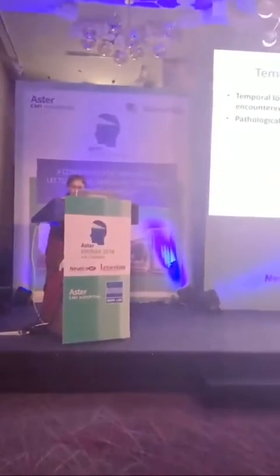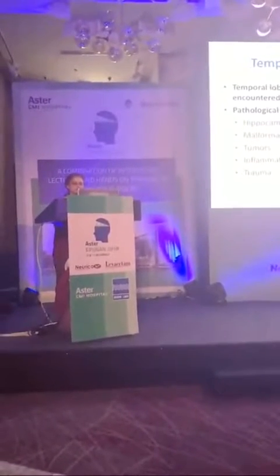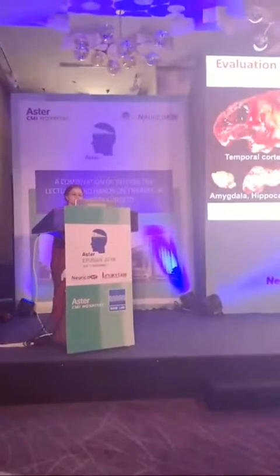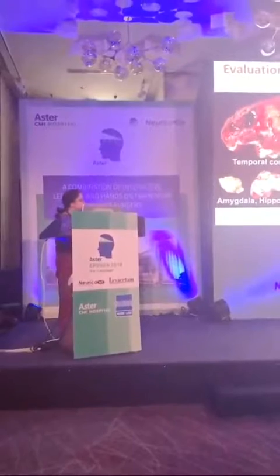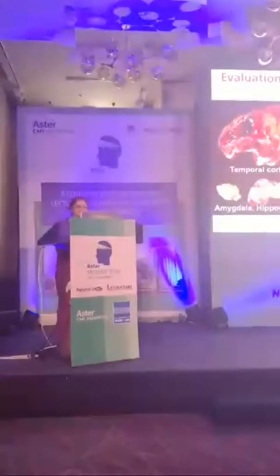These are the most frequently encountered specimens, and most commonly we see hippocampal sclerosis. So we will start with that. Now the surgical specimens that we receive from the surgeon include three things. You have the temporal cortex, the amygdala, and the hippocampus. And basically our job is very simple.